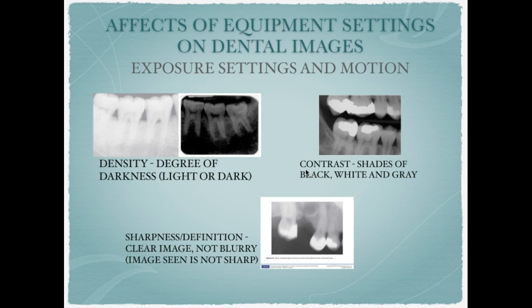Contrast. Contrast is affected by the power of the X-ray, the kilovoltage peak, the quality. This can be adjusted so that you have varying shades of black, white, and gray. So you can have short contrast or long contrast, how dark it is.